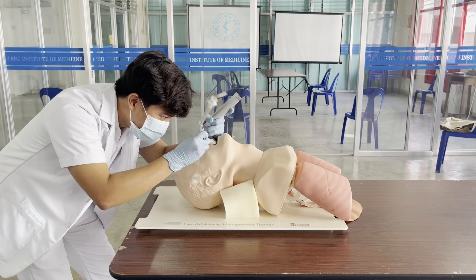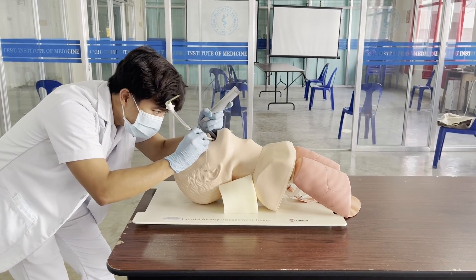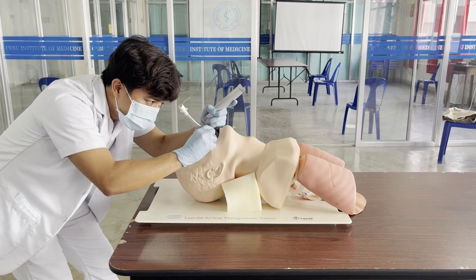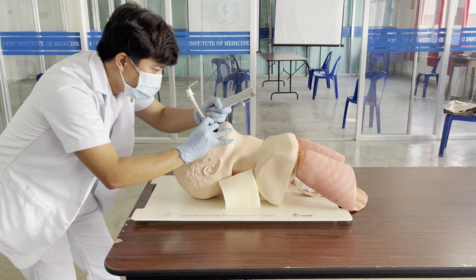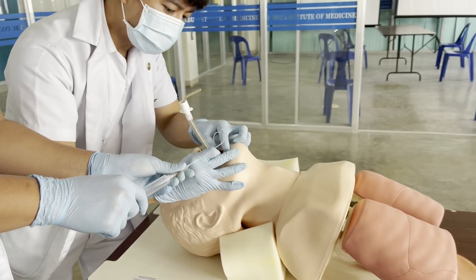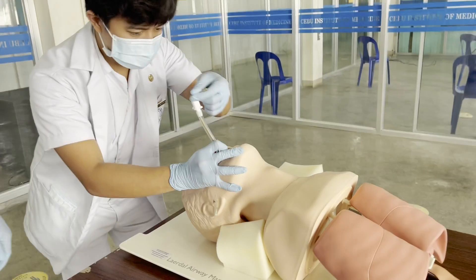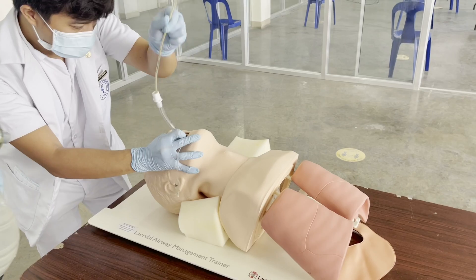Visualize the glottis opening. The endotracheal tube is then passed at the right corner of the mouth. The tip of the tube is passed through the glottis opening and is advanced by 2 cm until properly placed. Carefully remove the laryngoscope. Inflate the cuff using the 10 ml syringe. Remove the stylet carefully while holding the endotracheal tube.